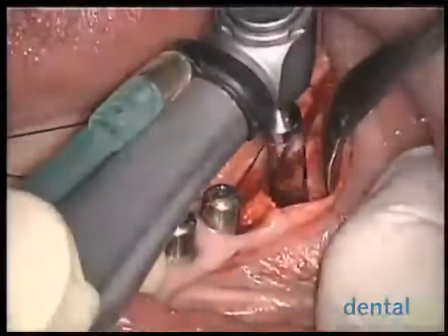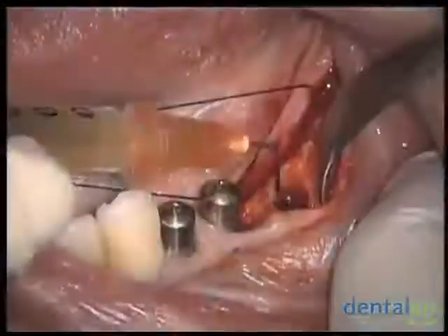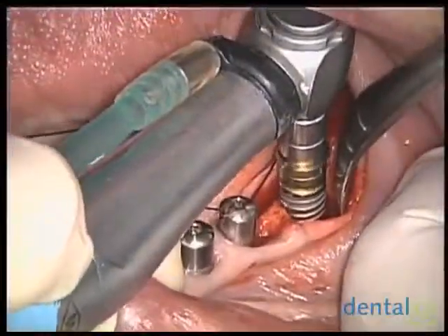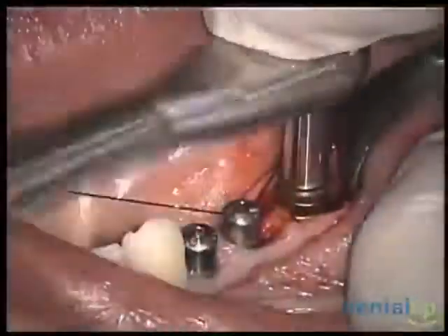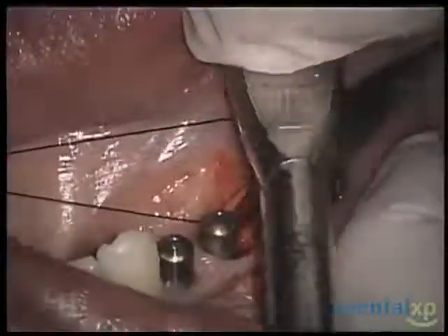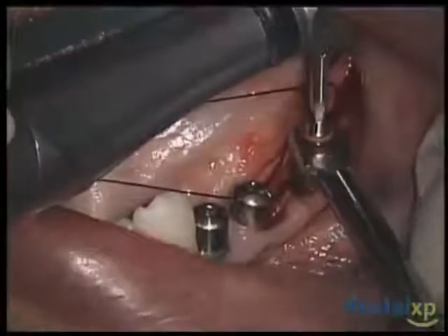Once the osteotomy is finished, we will go to the implant, we will wet the surface of the implant with PRGF, and the implant will be placed in the final osteotomy previously prepared. When we work with short length implants, we will always do it with the two-stage approach. We will place the implant, leave it submerged, and come back at a later stage and uncover the implant.